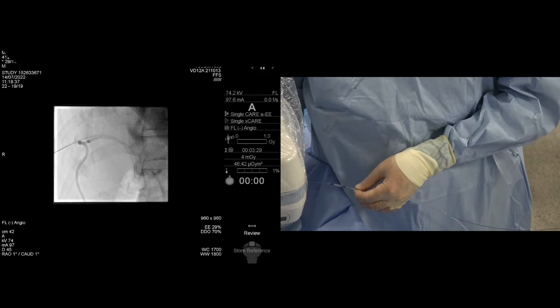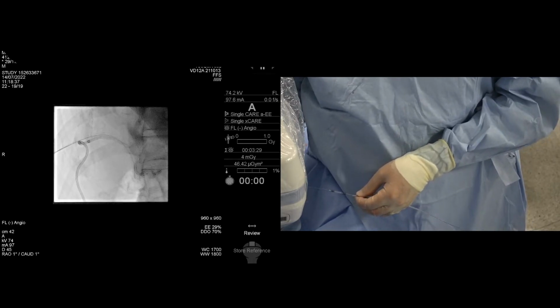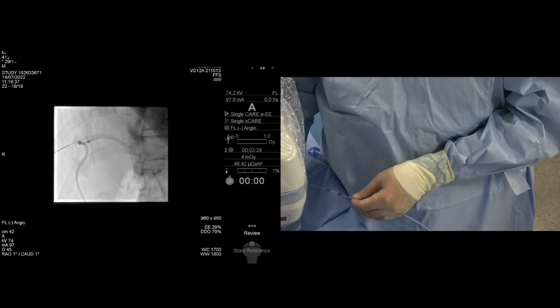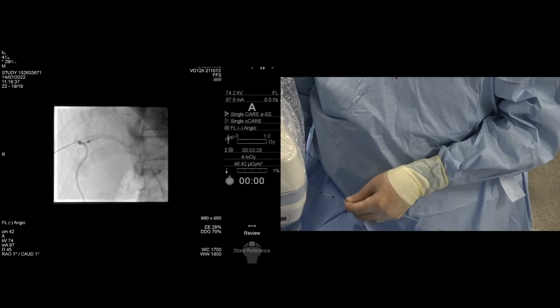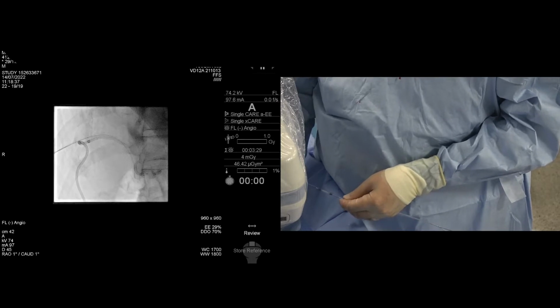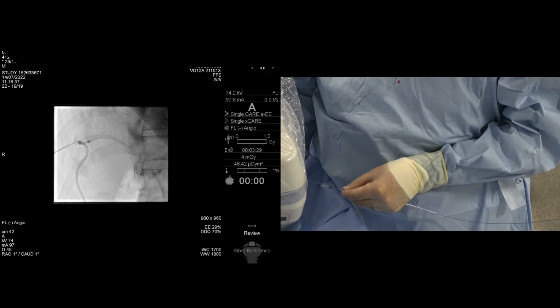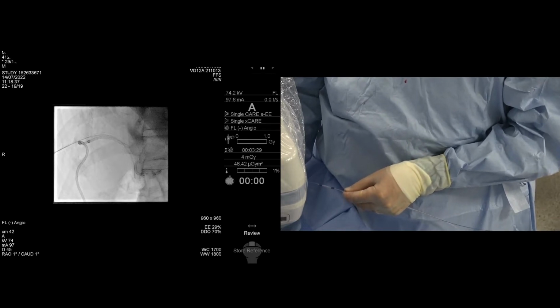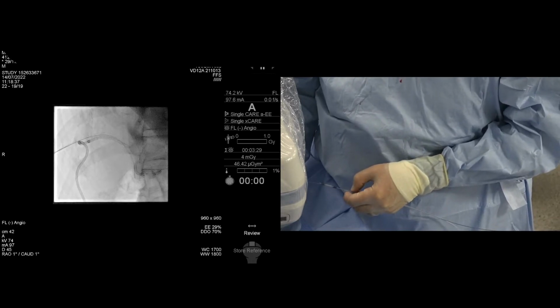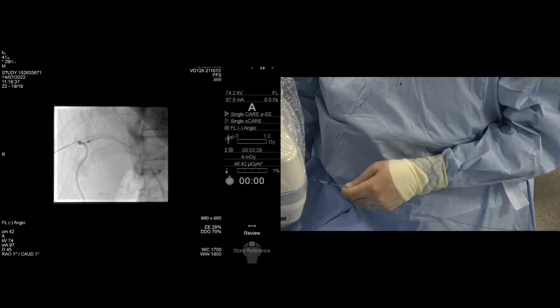Now, clearly this case is an unusual one because we're doing the procedure percutaneously rather than via a standard ERCP, but actually the rules remain the same, and in fact I think that our radiology colleagues perhaps don't push hard enough to make a pathological diagnosis, and there's no reason why they couldn't use this technique, which is the Steris Infinity brush.